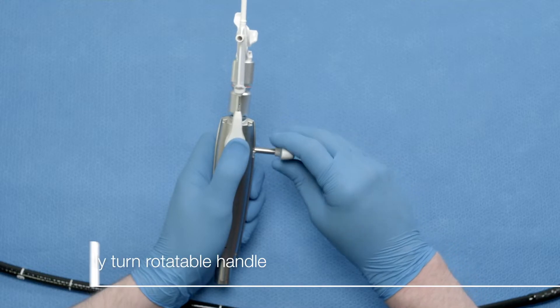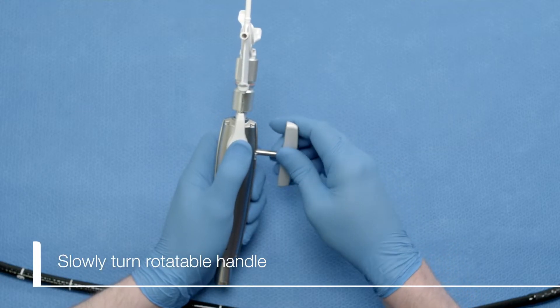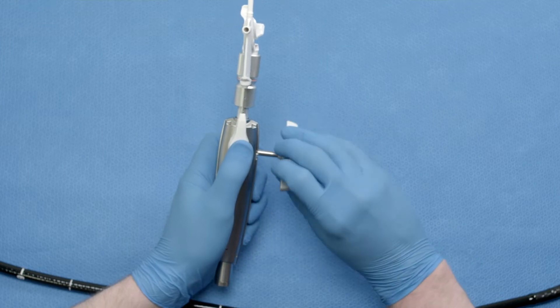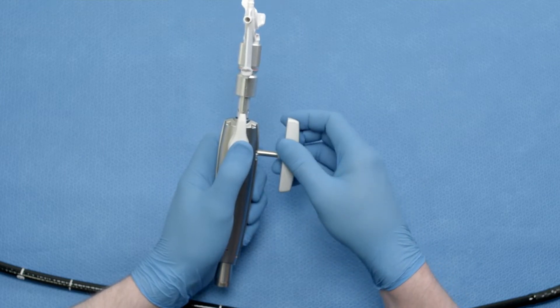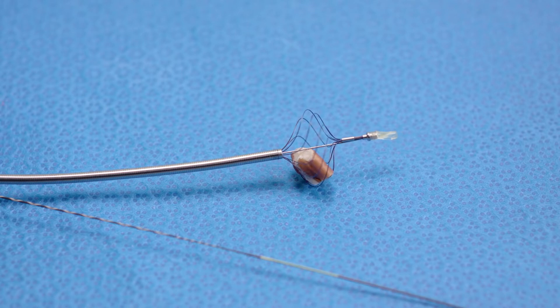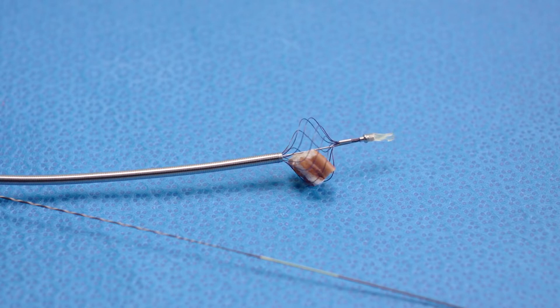Slowly turn the handle to close the basket around the stone and eventually crush the stone, or cause the basket to break. It is important to turn no faster than you see here, or the stone can slip out of the basket.